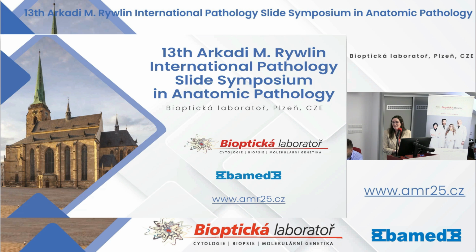And I find that this type of tumor, as you mentioned, has a characteristic appearance, but when you go to check your immunohistochemical results, the tumor is all over the place. In GYN, for us, the main thing to consider is a tumor of sex-cord differentiation. So we go immediately to SF1, and some of the cases can pick up SF1. They can pick up a little bit of inhibin. So they're all over the place.